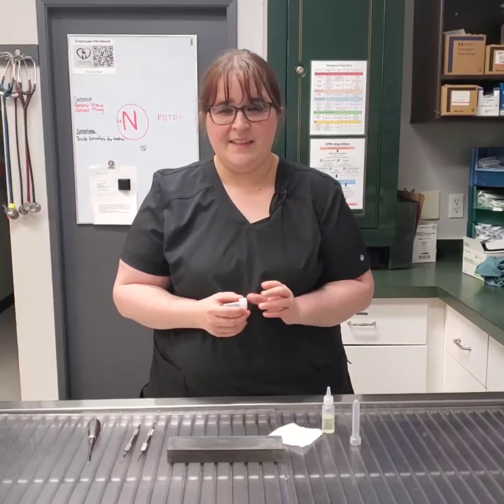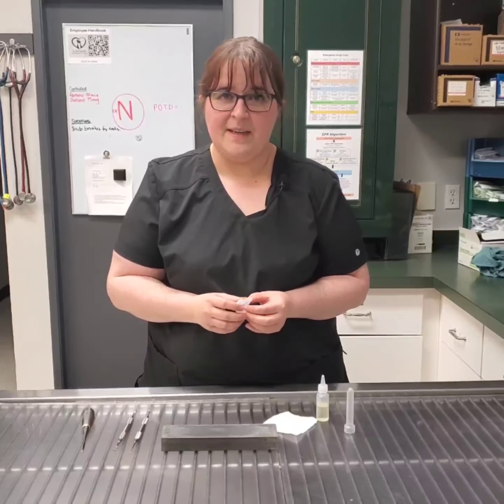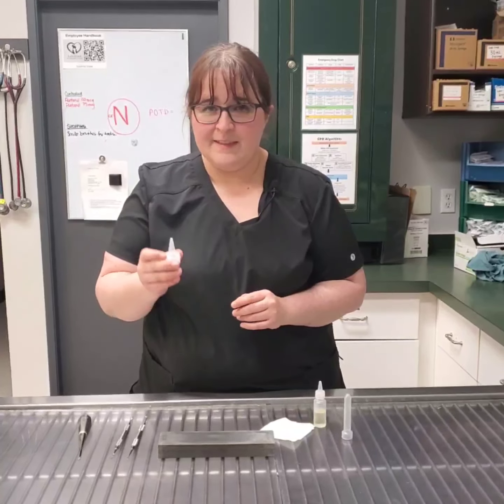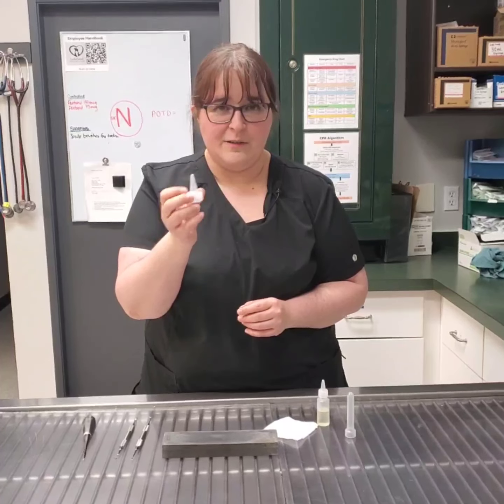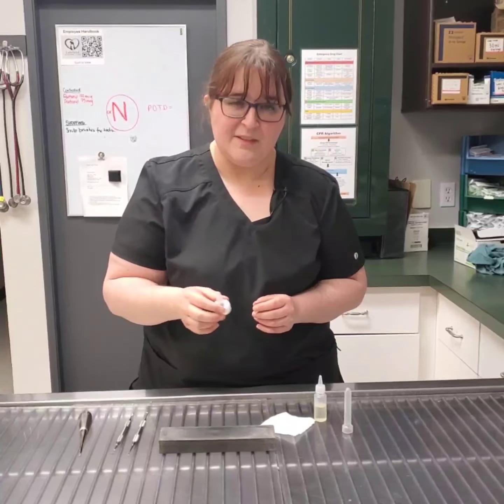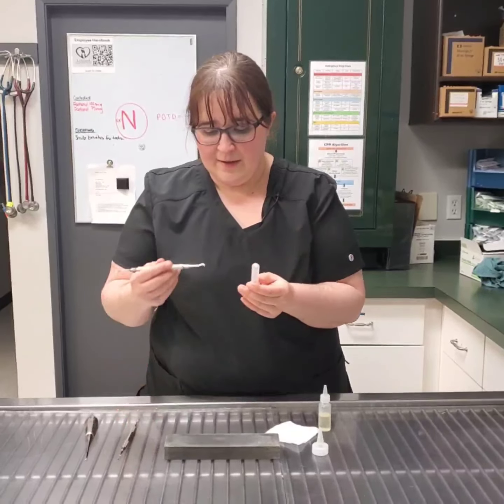Unfortunately, because my clinic sends our instruments away to be sharpened, I don't actually have a conical sharpening stone. So for the purpose of this, I'm going to pretend that this here is the conical sharpening stone. The conical sharpening stone is used to get rid of burrs and everything from the instruments, which I will show you. And I'm going to be using this syringe casing to test the sharpness of our instruments.